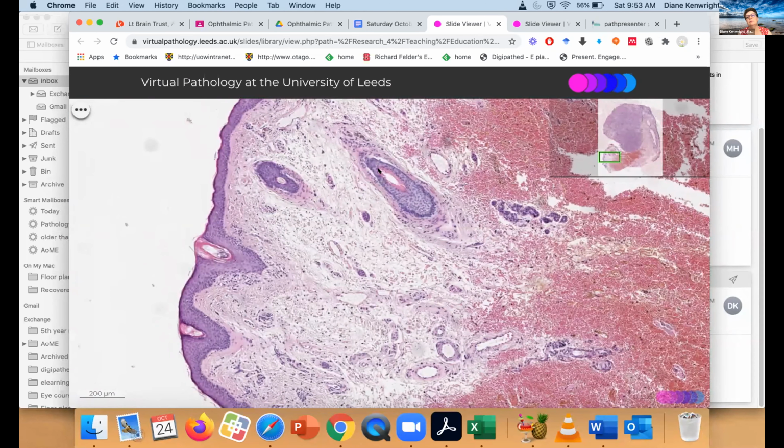Okay, do we have any comments or questions from the team? Can you just point out again the meibomian gland? Just sort of draw your thing around where that is. Yeah. And why has it got that huge white space in the middle? That's part of it. Yeah. So that's where it's just cutting through to the conjunctiva, actually, I think. Do you think that's a duct? It was lined by something. Squamous. It's kind of large. Coming out to the surface, probably. Yeah. It's a very big one.